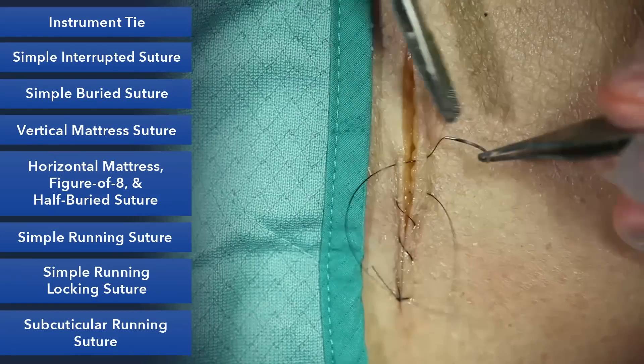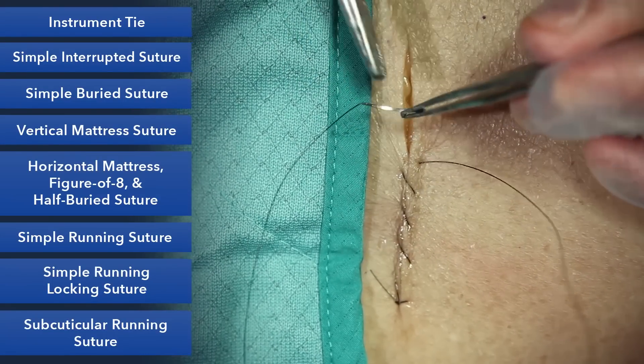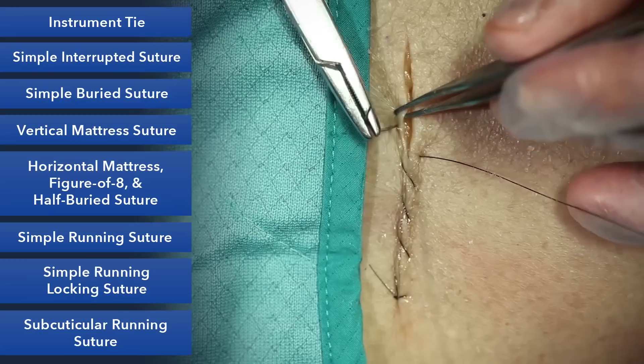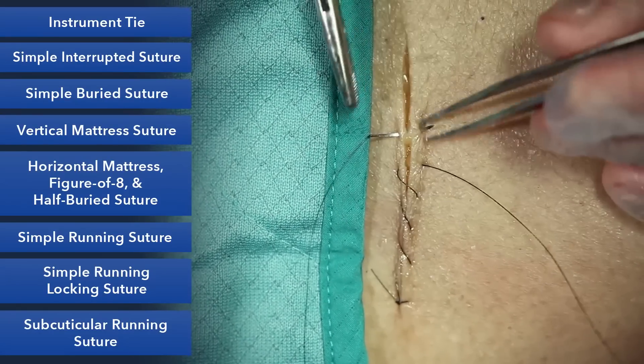People will ask, well, how much do you move along? My answer is as long as it's the same on both sides, it'll end up looking very nice. So be consistent in your bites.